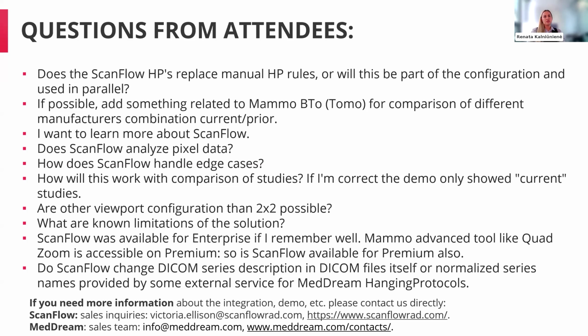What are known limitations of the solution? This is a great question, and it's important to know whenever you have a product what the limitations are for a solution. For ScanFlow, one of the main limitations that we're consistently working on is outside studies. Sometimes when a radiologist reads an outside study, there may be no DICOM metadata associated with that header. This DICOM metadata sequence naming is really institution specific and depends on where this information comes from. So it depends on where this outside MRI or CT came from, which institution.